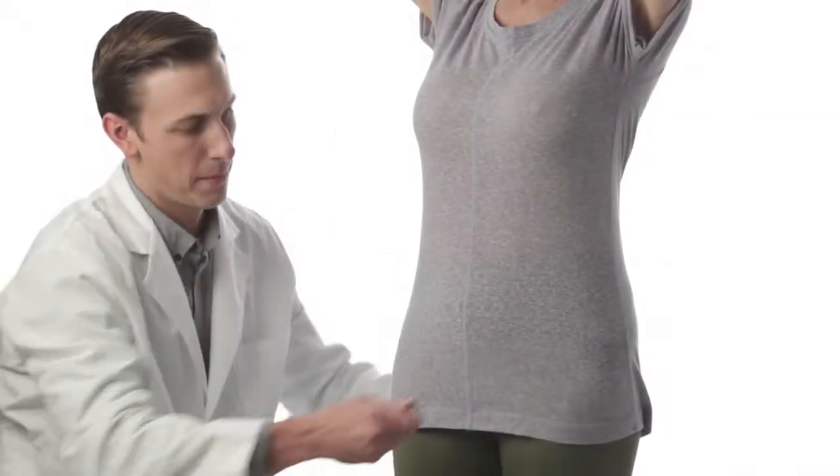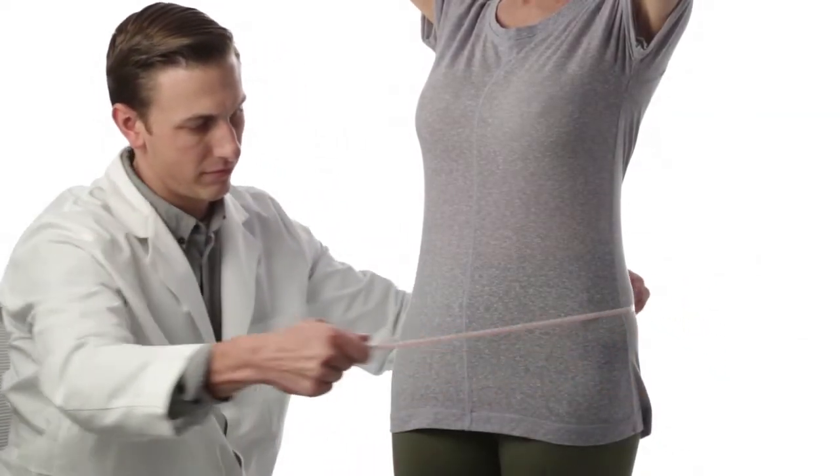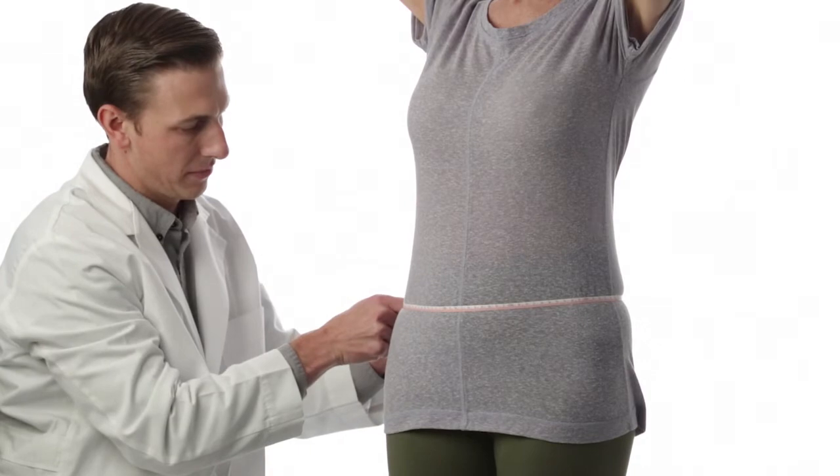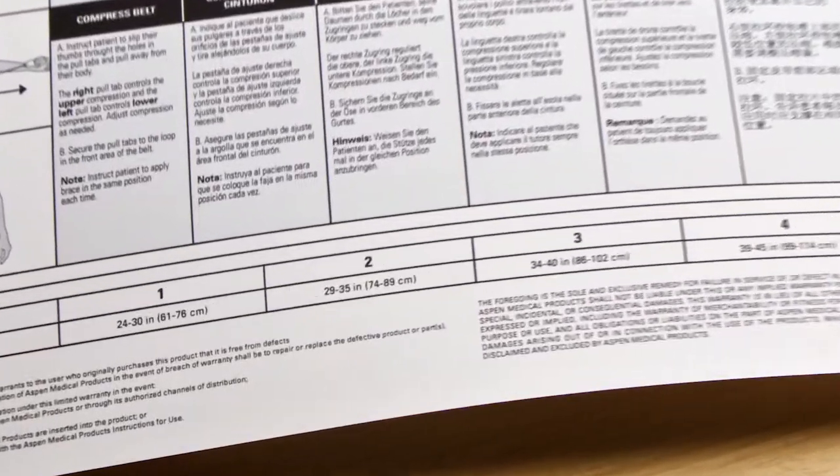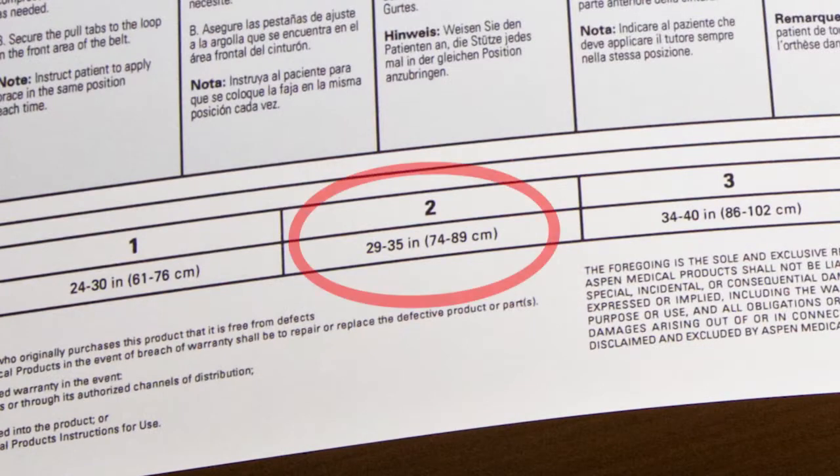To size the brace correctly, measure the patient's waist and select the correct size. For the adjustable brace, use the sizing chart in the instructions for use to determine the appropriate reference number.